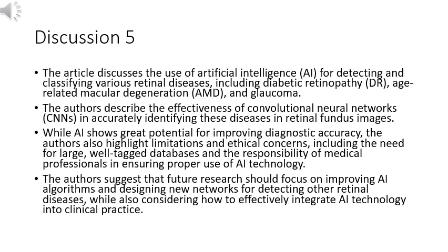From an ethical and legal point of view, AI is far from being reliable for general screening for retinal diseases. AI can detect DR, AMD, or suspected glaucoma perfectly, but we have to see what would happen and who is responsible in the event the algorithm fails when the system evaluates an image with uncommon findings, such as dystrophies, tumors, or minor infections.